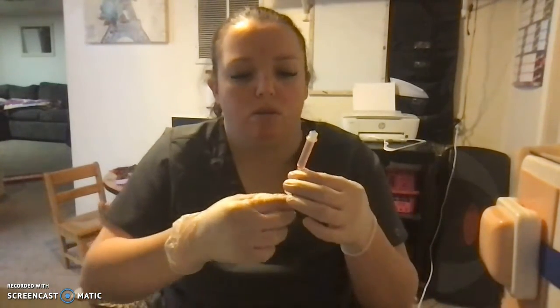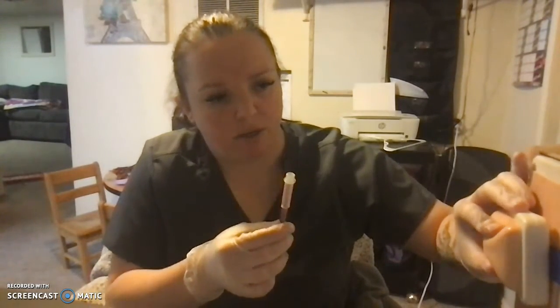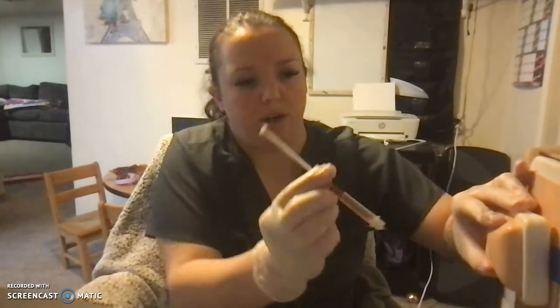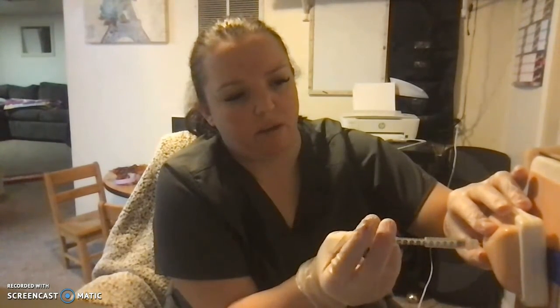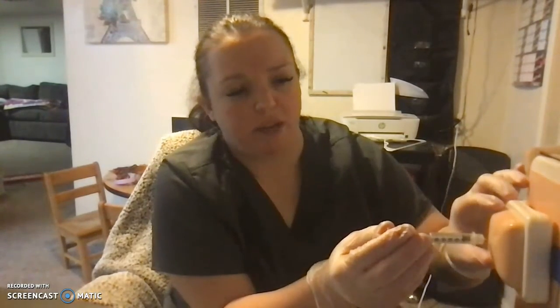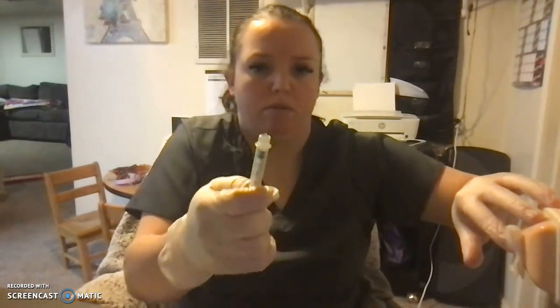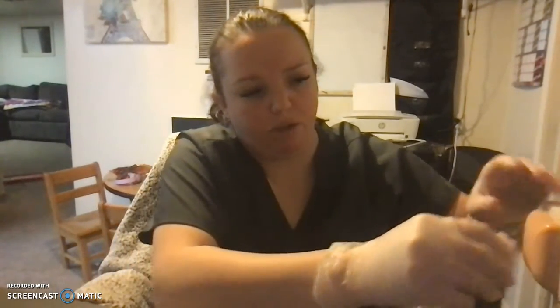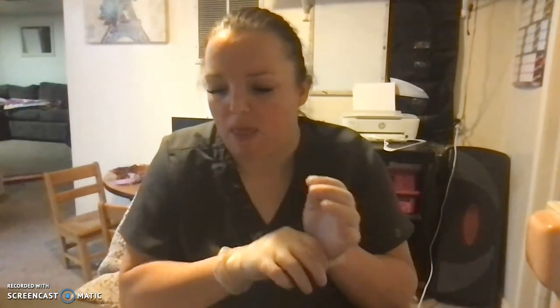All right. So then I would pinch the skin in the area that I was going to do it. I'm going to put it in at a 90-degree angle, like I'm throwing a dart. And then I'm going to get the medication in quickly. Oh, I would have released before I pushed that in. Push the medication in quickly. Hold my gauze. Activate my safety. Make sure that there's no bleeding or anything after giving the medication.